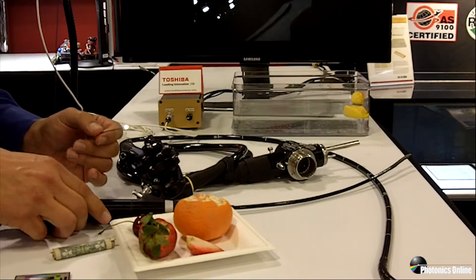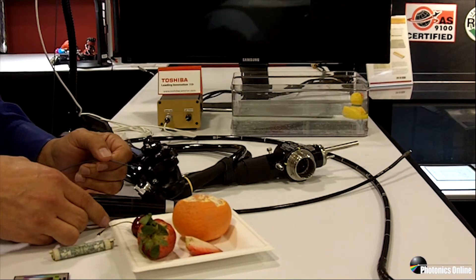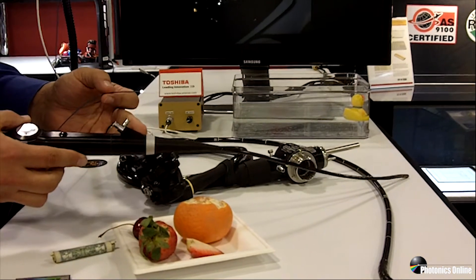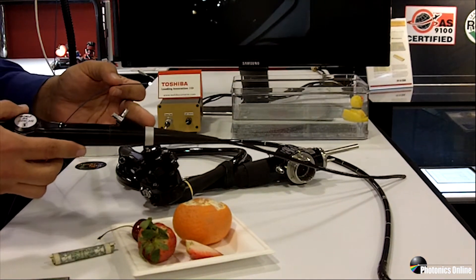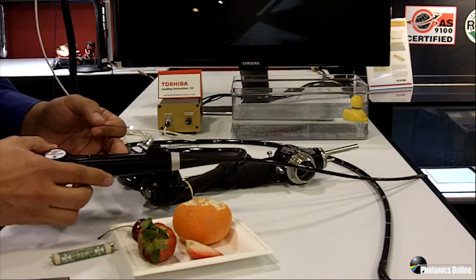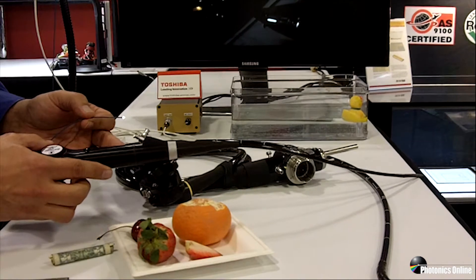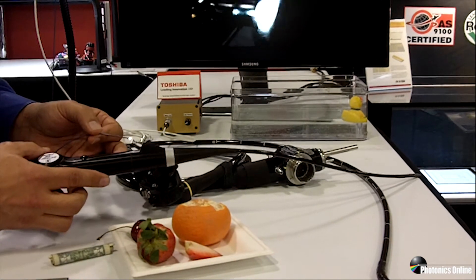While looking at fruit is interesting and helps showcase color and resolution, the SV-1000 was really intended to do lumen inspection of surgical endoscopes. Here's an example of a surgical cystoscope, which has a 2.2 millimeter diameter working channel.